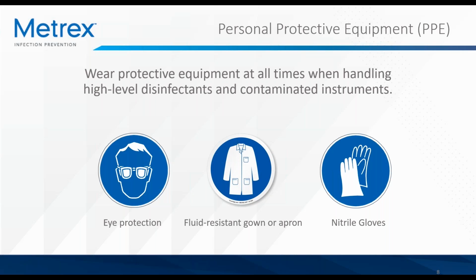You should wear eye protection to protect your eyes from splash and splatter that may occur when you're immersing or removing instruments from the solution. MetriCide OPA+ is a liquid solution, so you'll want to wear a fluid-resistant gown or apron. Nitrile gloves should be worn as well, especially if you're immersing instruments into the solution. You want to make sure the chemical isn't coming into contact with your hands.